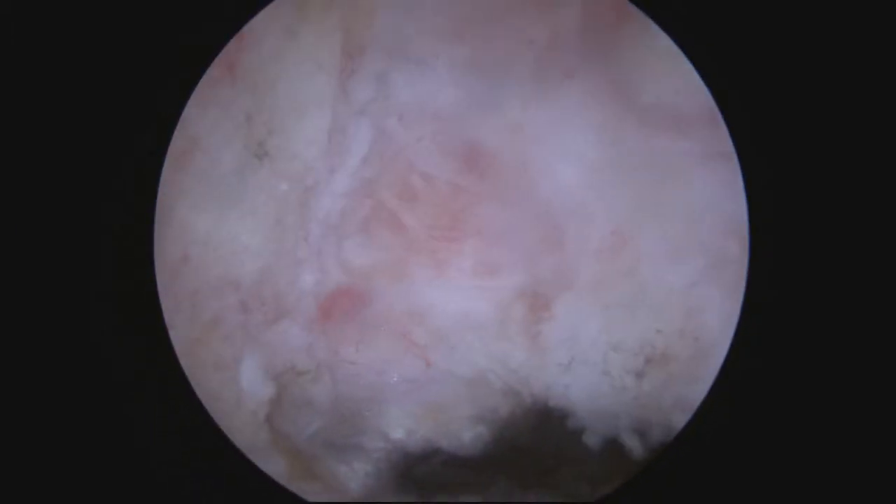There's a gap between the bone on the left and the bone on the right so that they no longer touch and cause pain. You see the gap right there? All done.